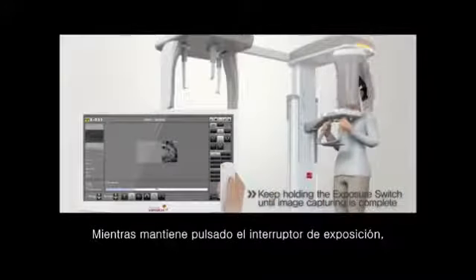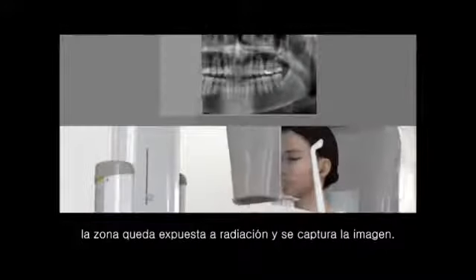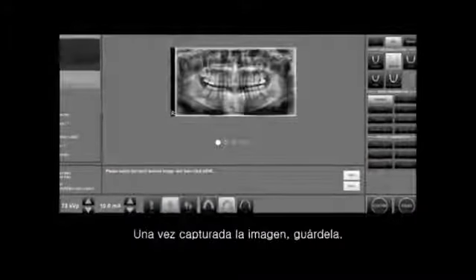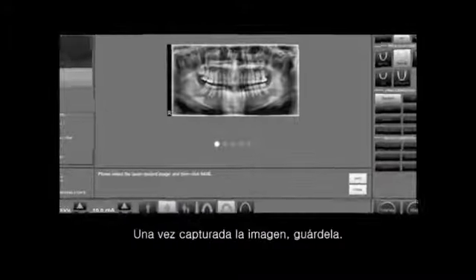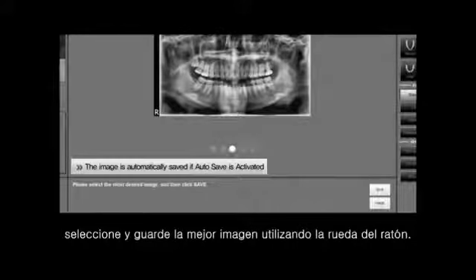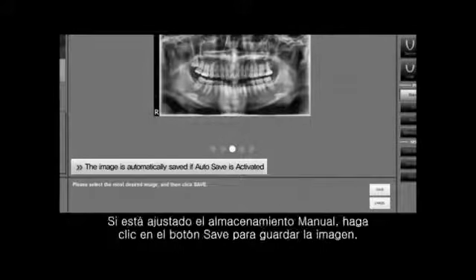While the exposure switch is held, radiation is exposed and proceeds taking the images. After the image acquisition, save the captured image. If you purchased license of AF mode, select and save the optimal image using mouse wheel. If the manual save is set, click the Save button to save the image.